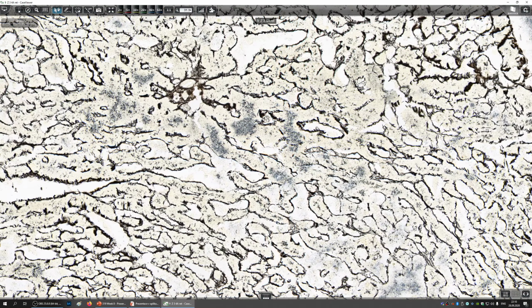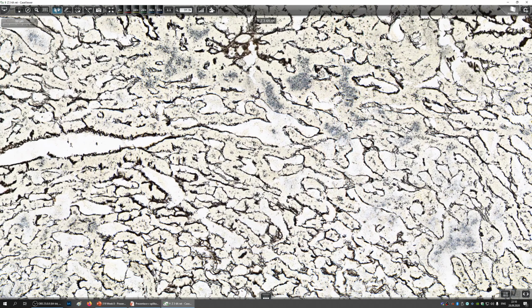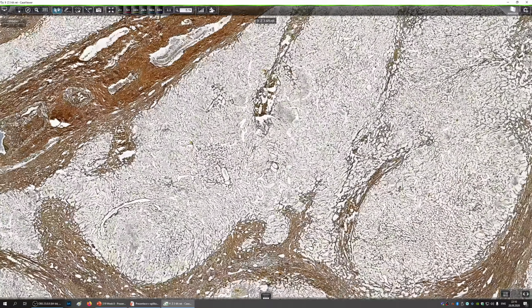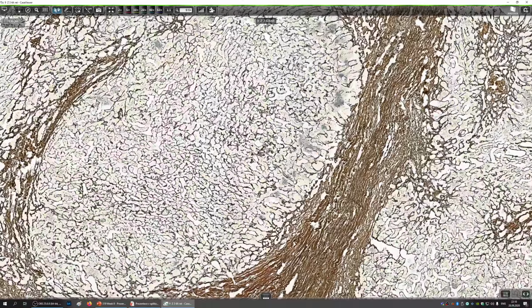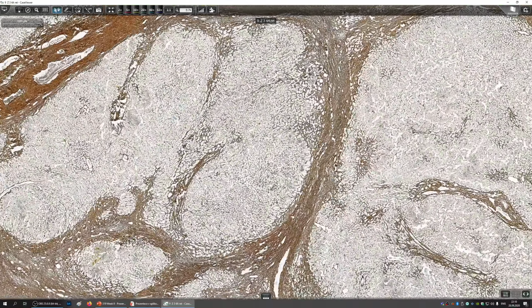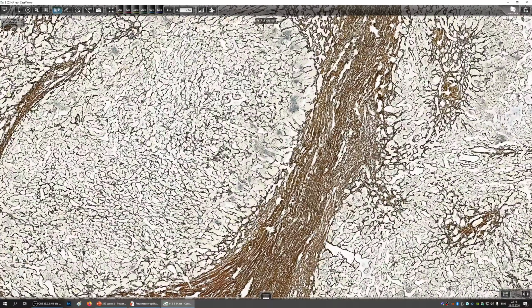if you look at this, when you take just this area, then you can see that the reticulin is just surrounding the cords of hepatocytes. This is how normal liver would look like, so if I got just this picture, I wouldn't even suspect that something's going on. But when we zoom out and we check out the bridges of collagen among the nodules, you can see that there's a lot of reticulin as well.